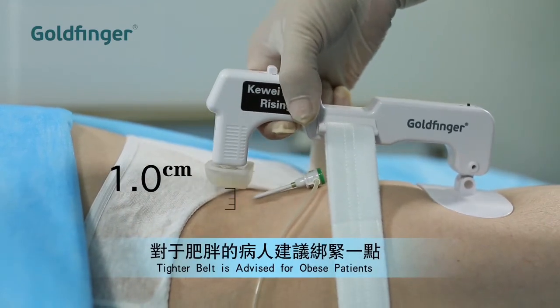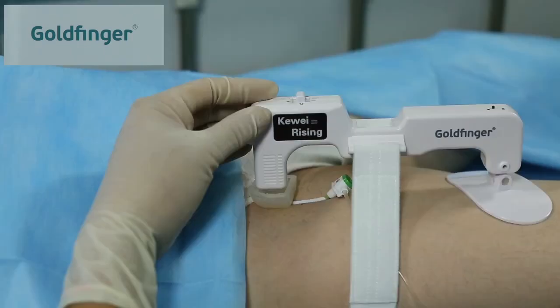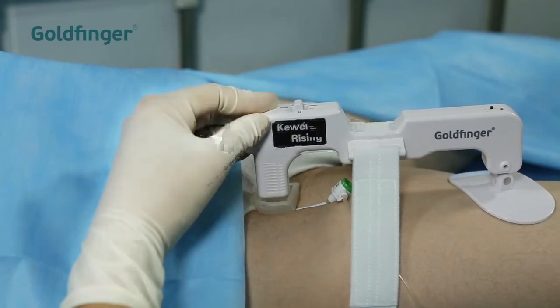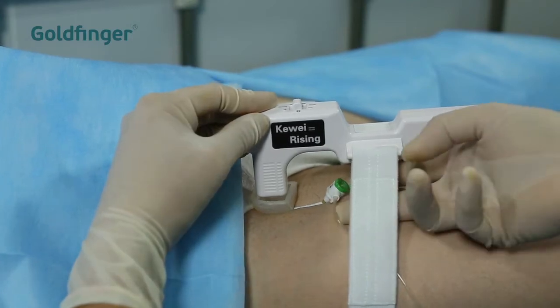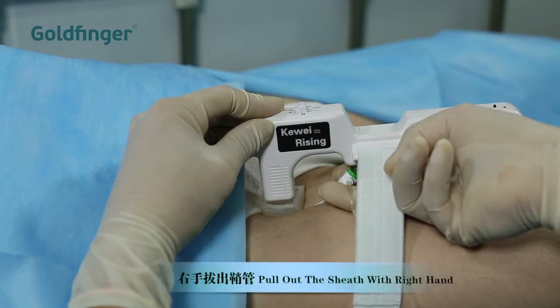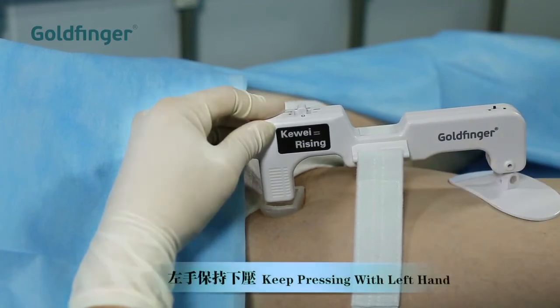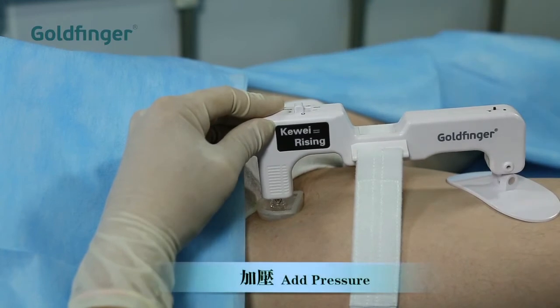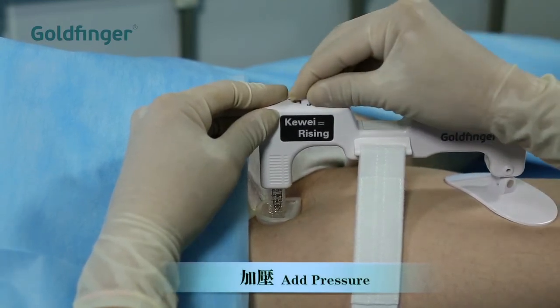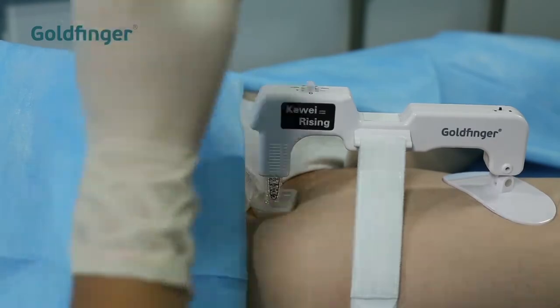For obese patients whose thighs are thick and soft, it is advised to make the belt a bit tighter. When removing the sheath, press down the superior end of the unit with your left hand to prevent bleeding. Pull out the sheath with the right hand. Keep pressing down with your left hand. Switch the pressure button to increase pressure.